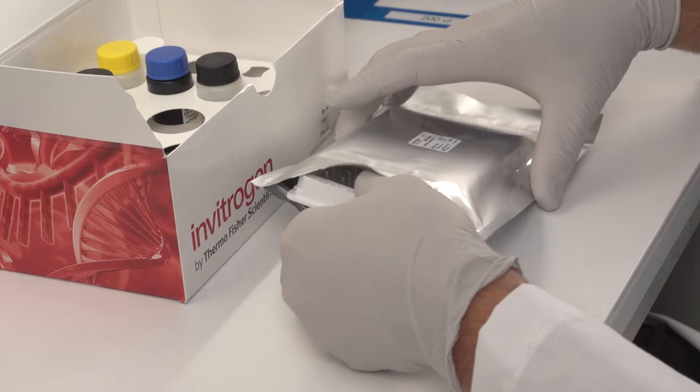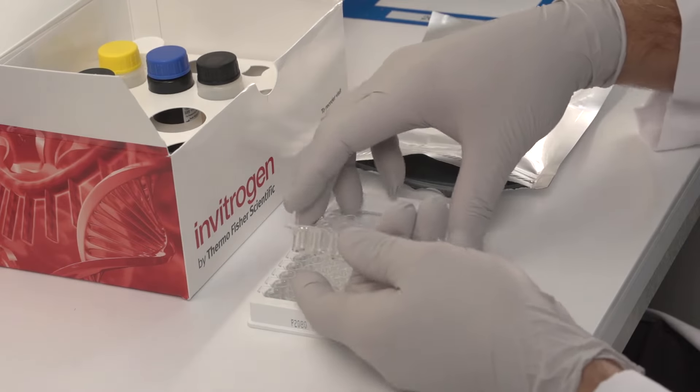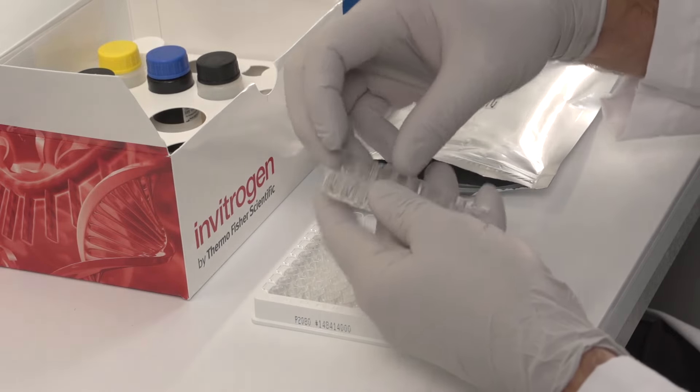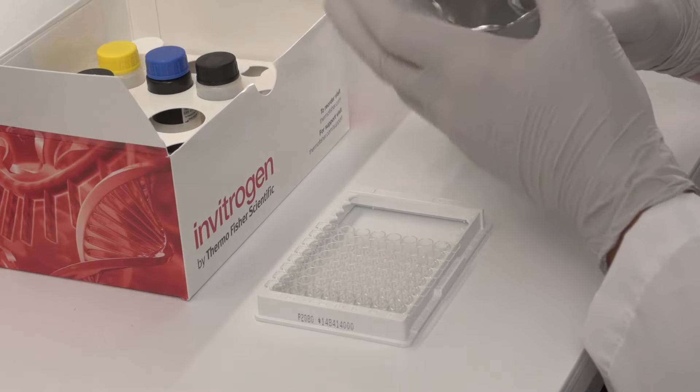Open the foil pouch to remove the plate and remove any 8-well strips that will not be needed for the current run. Unused strips can be re-bagged and stored at 2 to 8 degrees Celsius for future use.